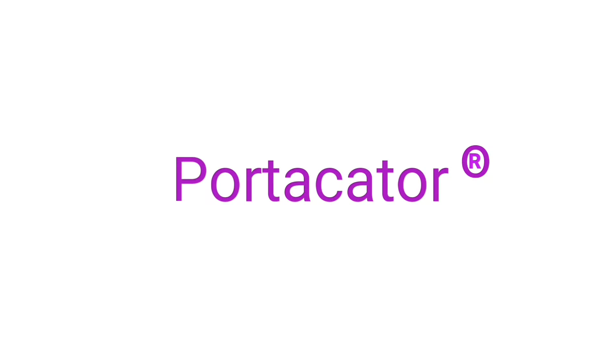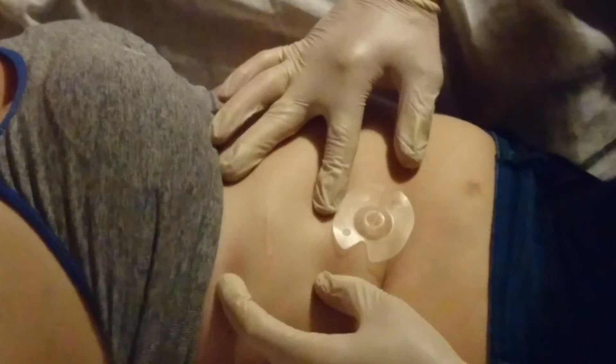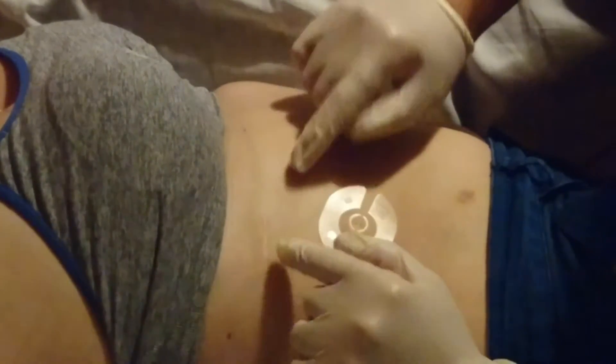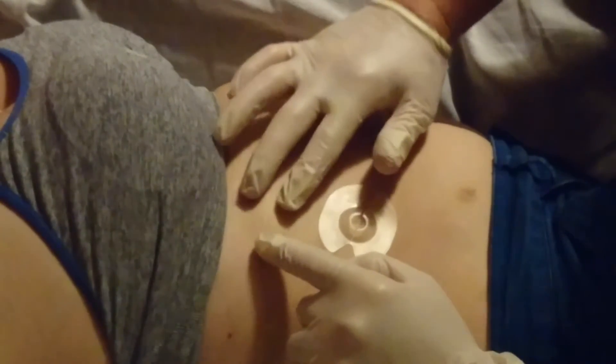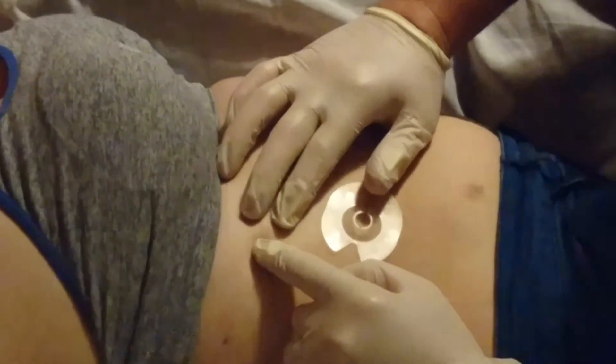The port-a-cath location device. It can be hard to see the port under the skin, and it also moves when you're trying to hold it still. The port-a-cater aims to give the stability of three fingers whilst the visibility of two.